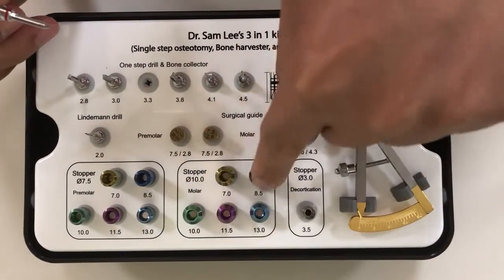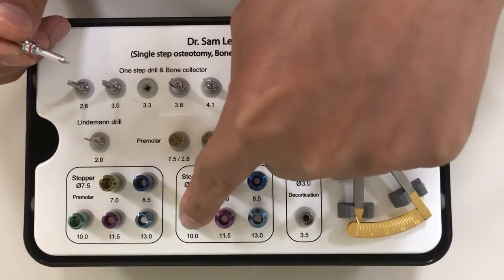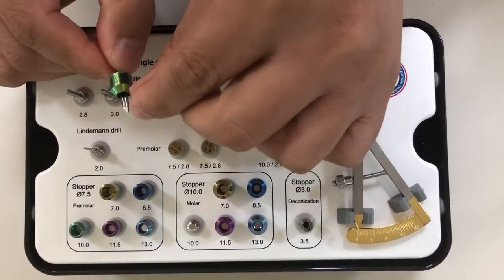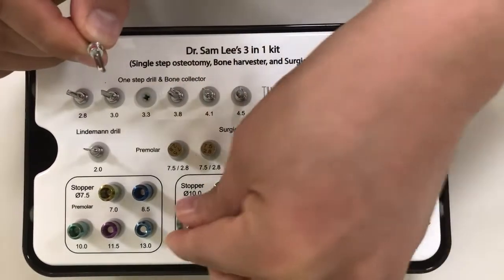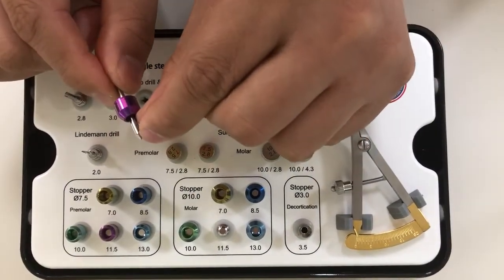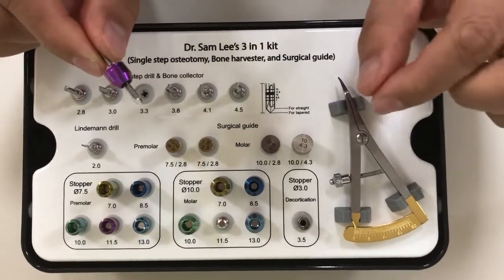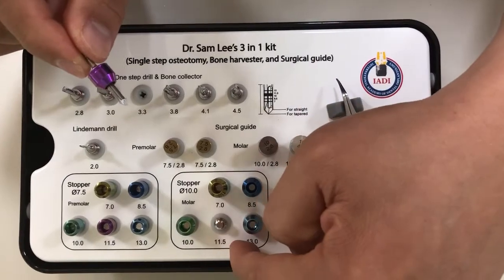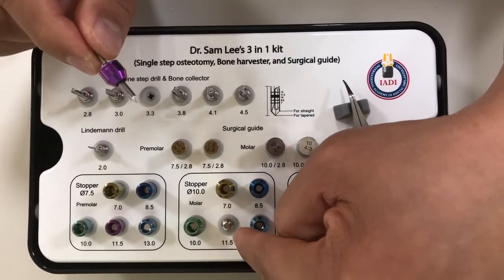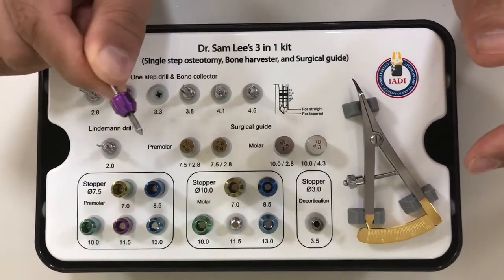If you want to place a 10 millimeter length implant on the molar side, you use this; on the bicuspid side, you use this. For the molar side, instead of choosing the stopper that gives exactly 10 millimeters, you want to use the 11.5 millimeter vertical stopper, because every implant needs to be drilled a little bit deeper. If you want to place a 10 millimeter implant, you have to go 1.5 millimeters deeper, especially when placing a bone-level implant.